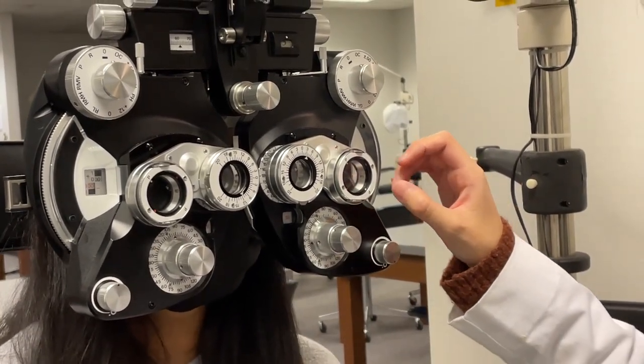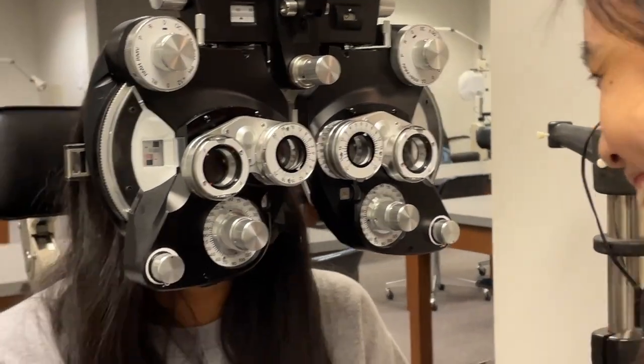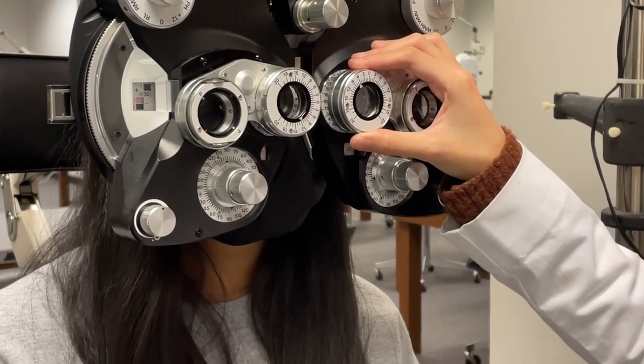You're an ESO? Mm-hmm. Oh, I didn't know that. Oh wait, I did cover tests, so I should know that. Now you know that. So, all right, now I'm going to go 12 the opposite direction.